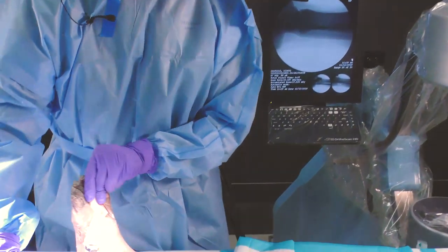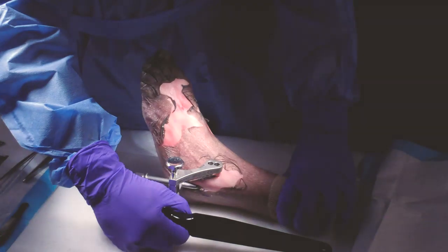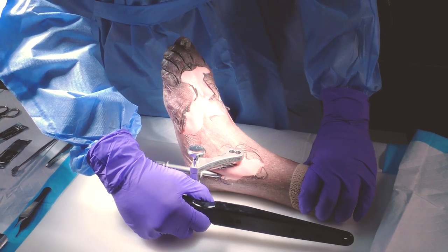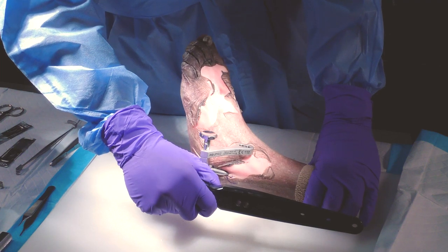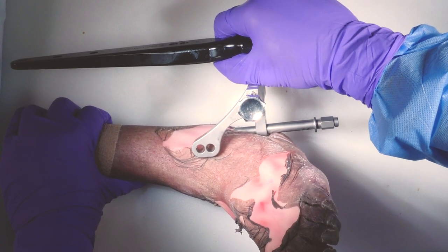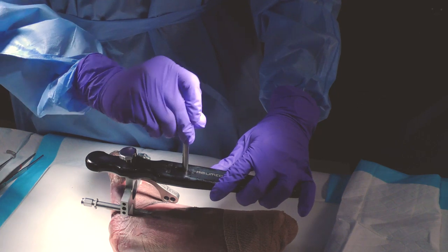So now this is the most important part. This is a specimen, so there's no fracture. You typically apply traction and distraction in order to restore the normal length, and then you typically rotate internally because most of these fractures are externally rotated. Once you have done that, you need to fix the proximal locking screws, and that's precisely what we're going to do right now.